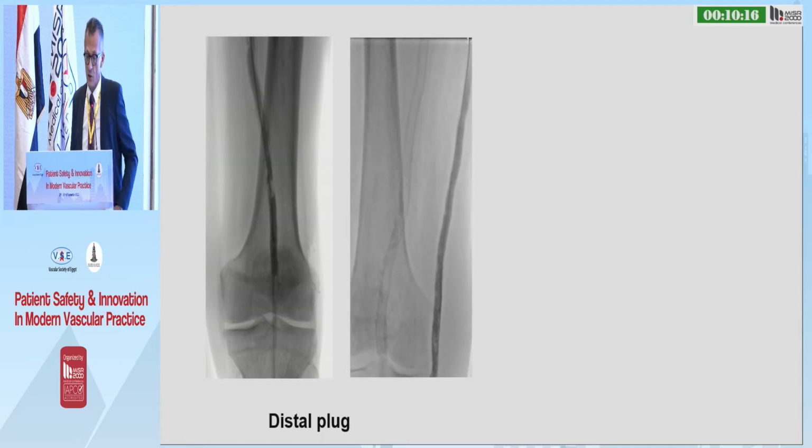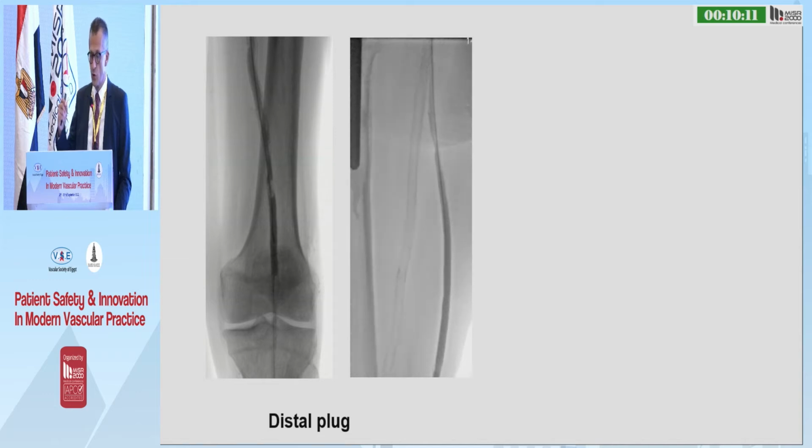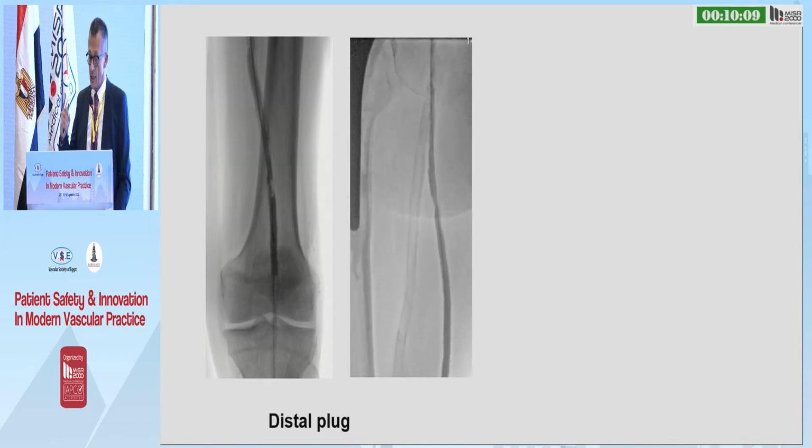Again, to reduce the risk of distal embolization, I think it is really important, at the fourth passage of the device, to stop the procedure 1-2 centimeters above the last part of the occlusion to maintain a distal cap, and then to inject contrast medium to see in a retrograde way the effectiveness of our treatment. Only then, when we are sure to have removed all thrombotic material, do we go through the last part of the occlusion really slowly, because at the time of flow restoration there is a high risk of distal embolization.